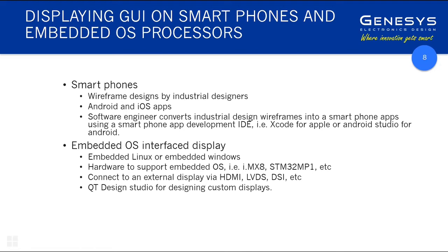And then there are things like Qt Design Studio for designing custom displays. That's one particular studio where, in some cases, industrial designers and software engineers can collaborate on the tool, where the designers can make the design, and then the engineer can work with them to turn that into actual displays that go on the screen.